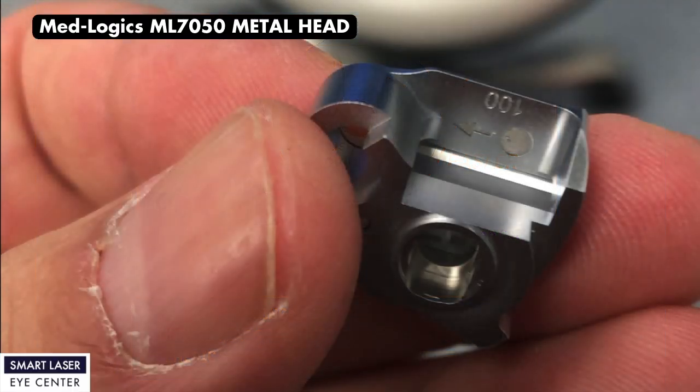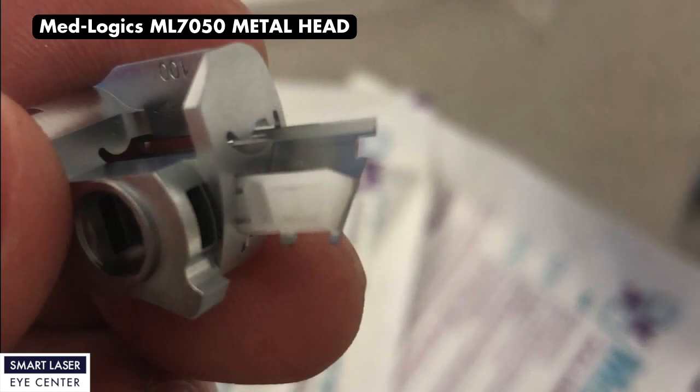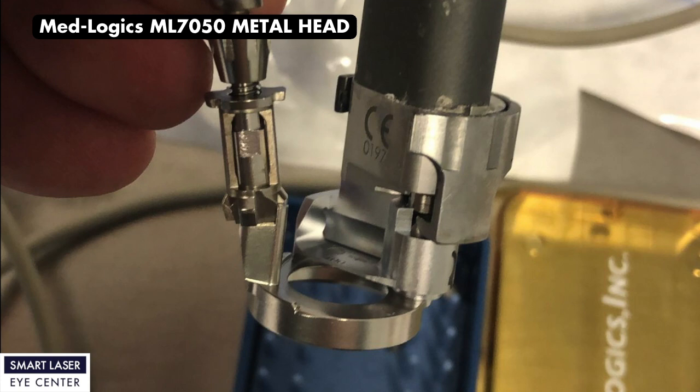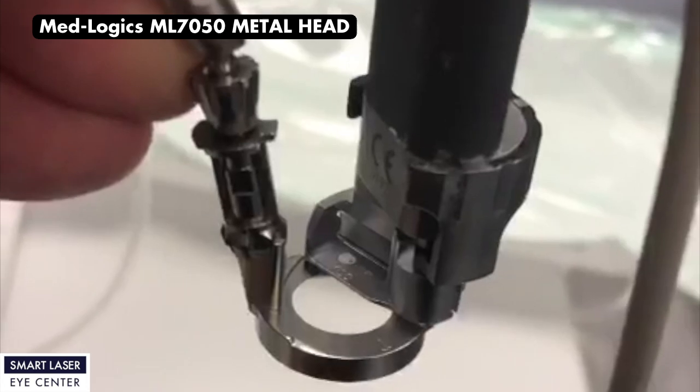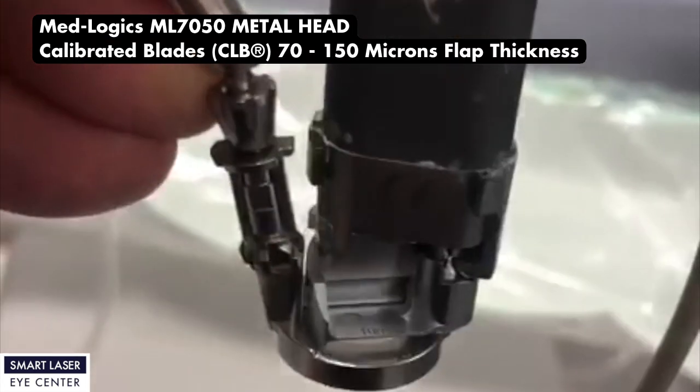If you want to continue using your Moria M2 microkeratome more safely, we recommend using the M2 with the ML-7050 metal head. This way, you can minimize your buttonhole risk and create your corneal flaps with a tolerance of plus or minus 5 microns. With calibrated blades, you can create flap thickness from 70 microns to 150 microns.